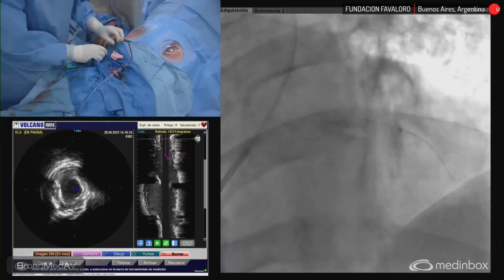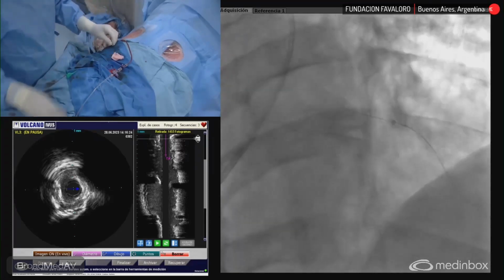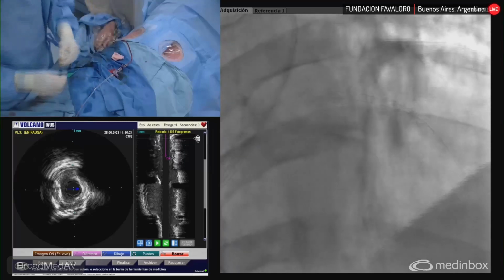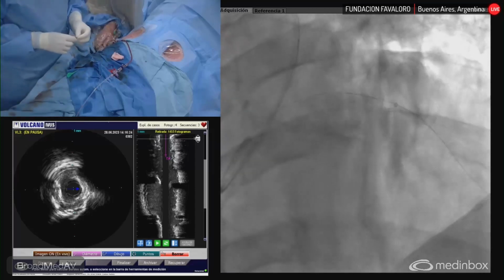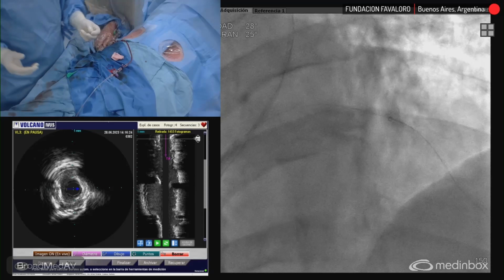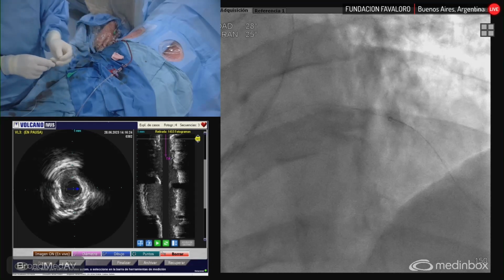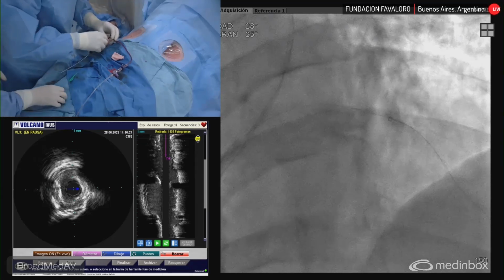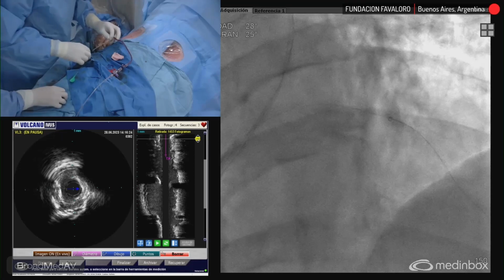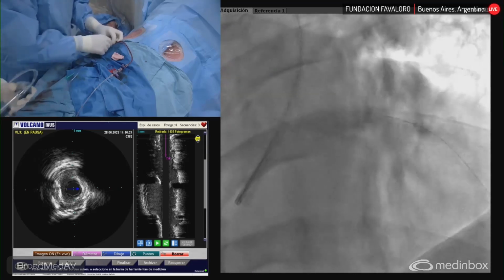Anyway, as we saw at the IVUS, a deep as well as superficial calcification, I think that cutting balloon will be the right option. Do you think so? Yeah, probably yes. It's also an option here. It could help, the other ablation device. Rotablator is not an option, although the wire now looks very straight. There's a significant curve there, and I don't know what can be the outcome of the rotablator. Probably we can have a perforation. It's something that I don't like to have on live transmissions, not in real life either, of course.